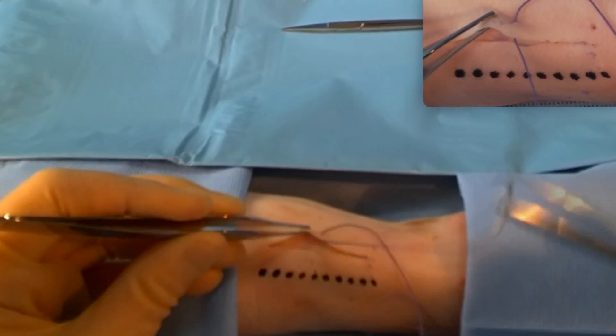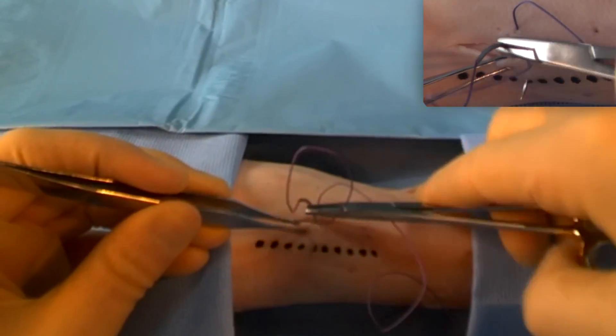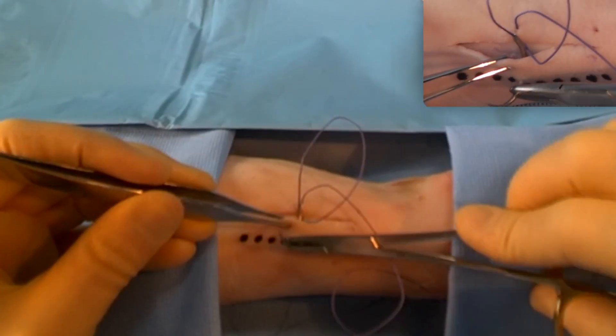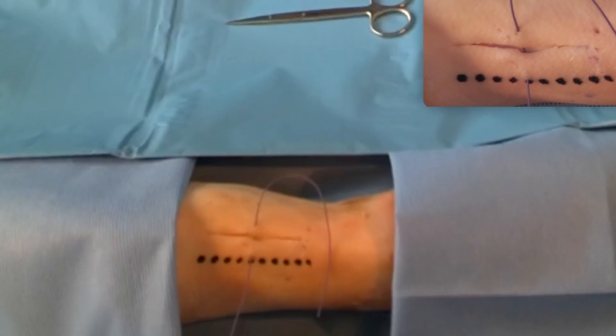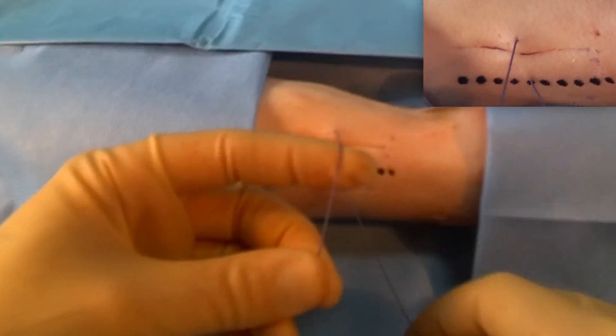Then picking it up, coming out the other side. Again, the same thing — trying to pick it up roughly where you want to use it, and then pulling that needle through safely without poking your needle in your assistant's eye.